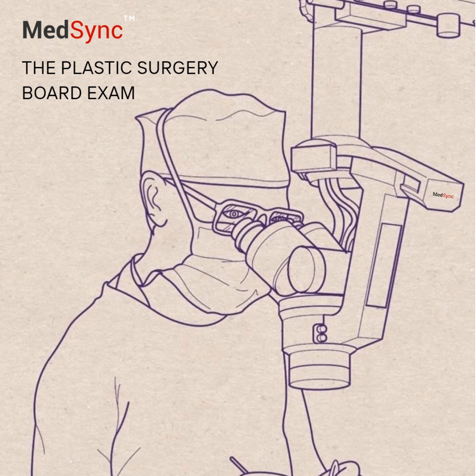How's it applied? Typically, adhesive strips just lateral to the incision line, then a non-adherent layer directly over the incision, then the sponge over the non-adherent layer, avoiding direct skin contact if possible, occlusive dressing, and lower negative pressure, maybe 50 to 125 mmHg for just a few days, like 2 to 5 days post-op.